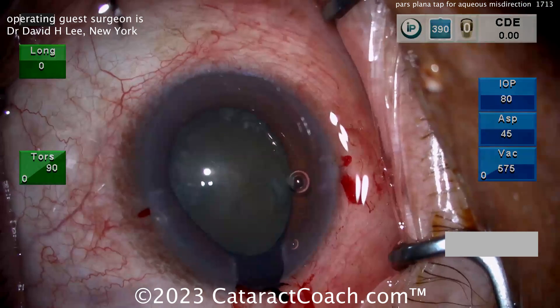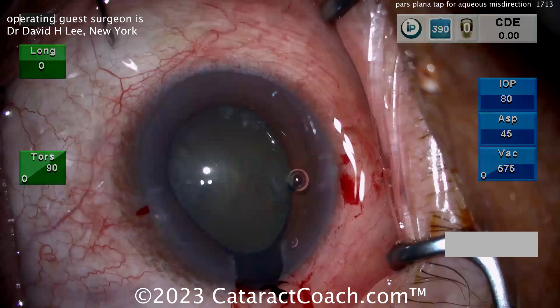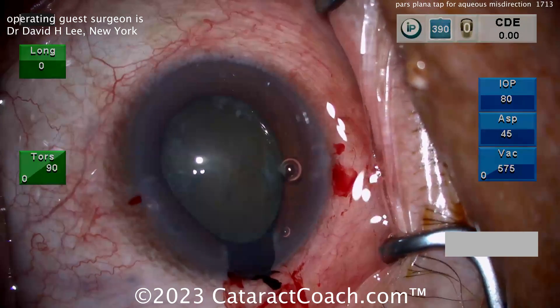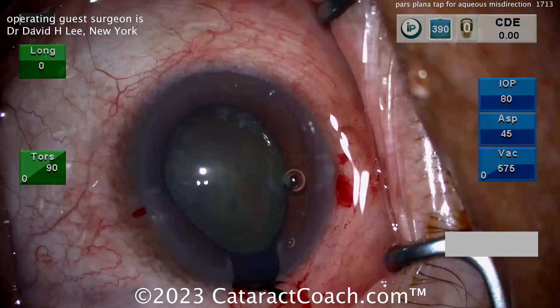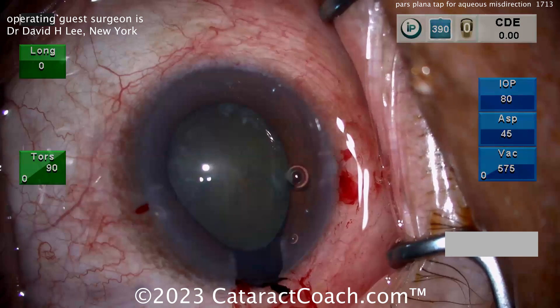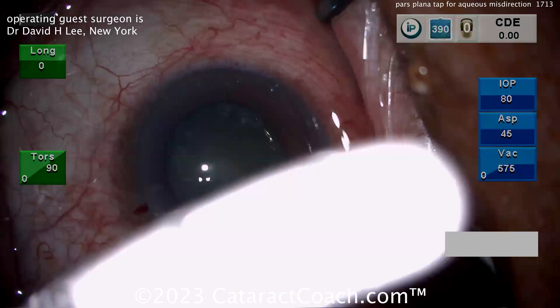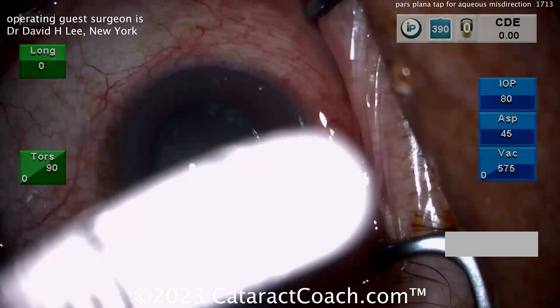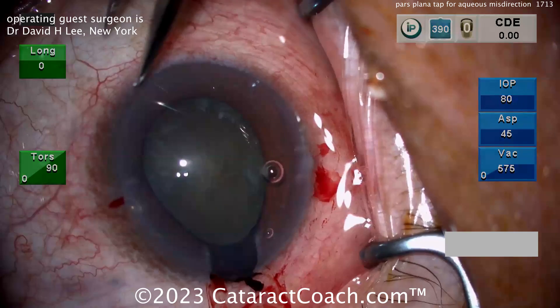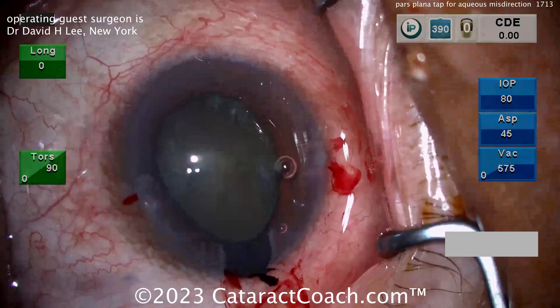The needle is going in, measuring appropriately — going into the pars plana just like you're doing an intravitreal injection, going far enough back so it won't hit the lens or the lens equator. Calipers are coming in to measure. Another pearl: put a little BSS in the syringe first and move the plunger back and forth so it's not stuck — it's already lubed up with balanced salt solution. Then you aspirate. Measuring at least 3 millimeters, probably about 3.5 millimeters back in most eyes.